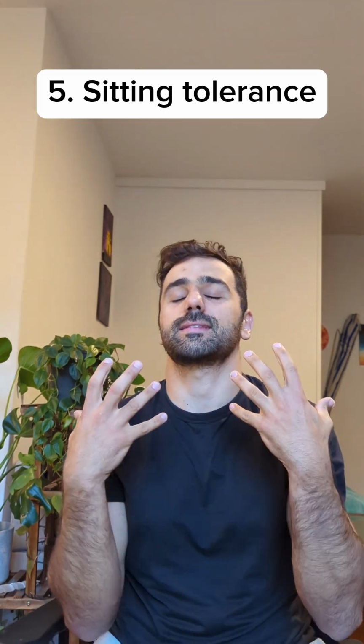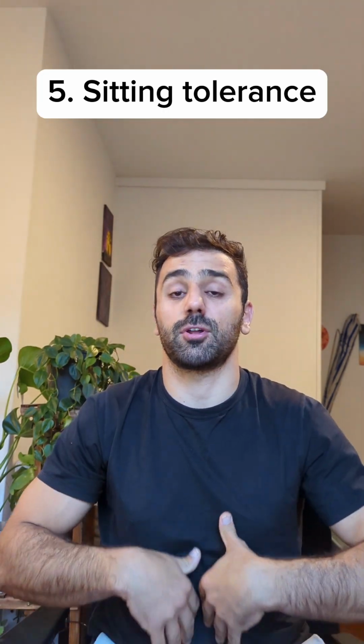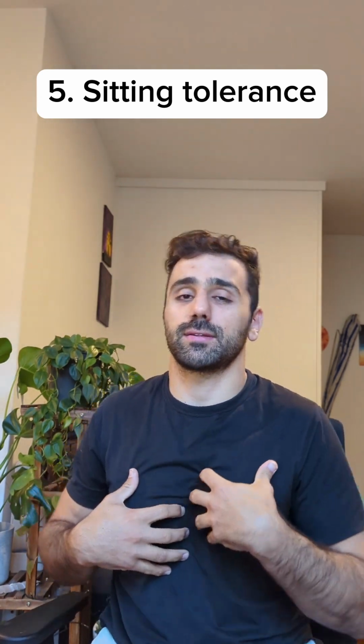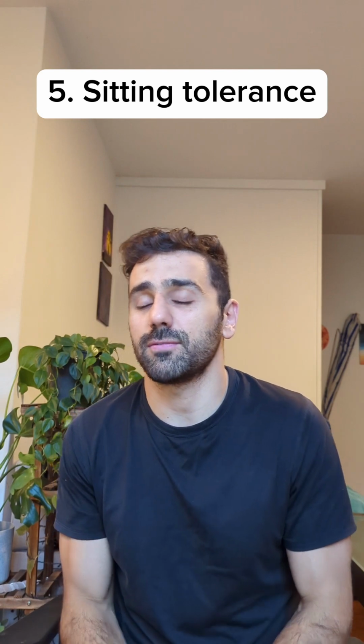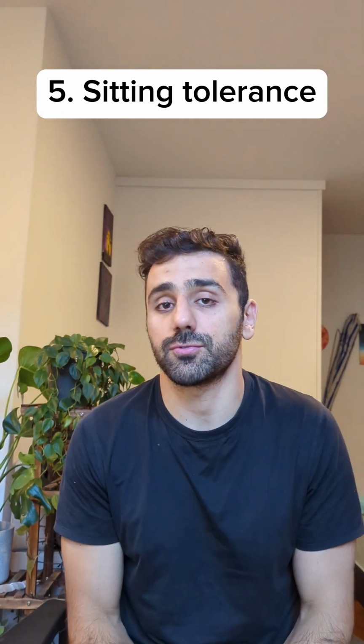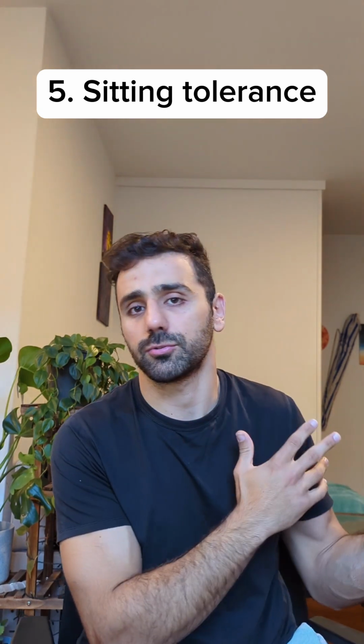And lastly, it's sitting tolerance. Not many of us can tolerate upright seating all day, especially if we have physical limitations that don't allow us to reposition. If someone is in the chair for at least 8 hours a day, having the ability to tilt can reduce the need for a transfer, whether it be back into bed or lying onto a couch or whatever it may be.